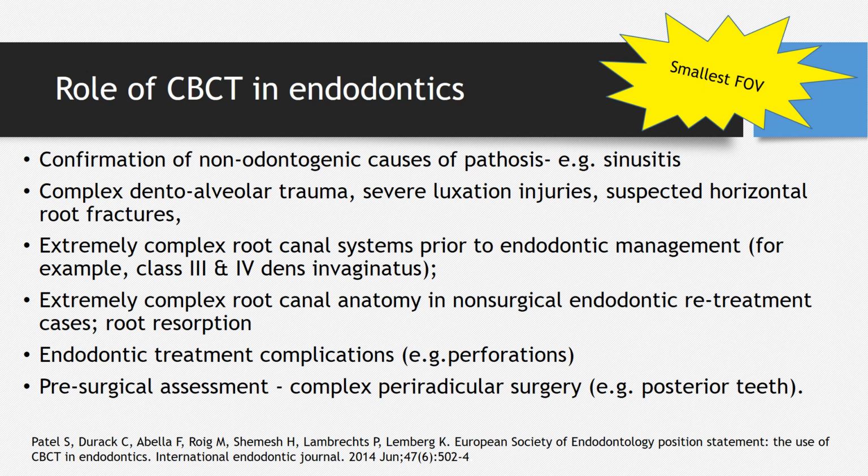Extremely complex root canal anatomy in non-surgical endodontic retreatment cases, root resorption cases, endodontic treatment complications when you're suspecting a perforation, pre-surgical assessment of complex periradicular surgery, for example for posterior teeth.